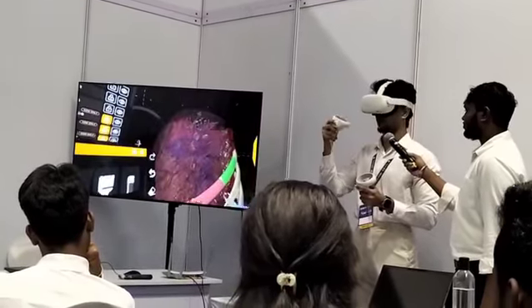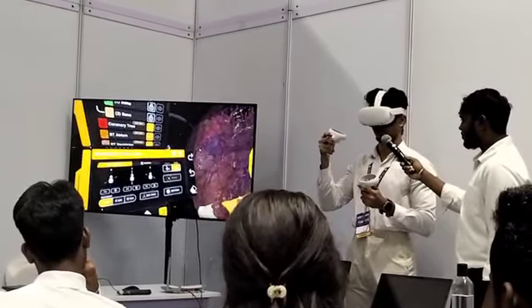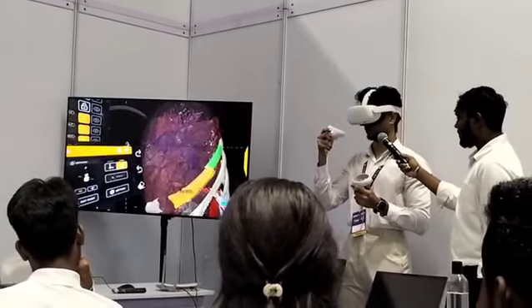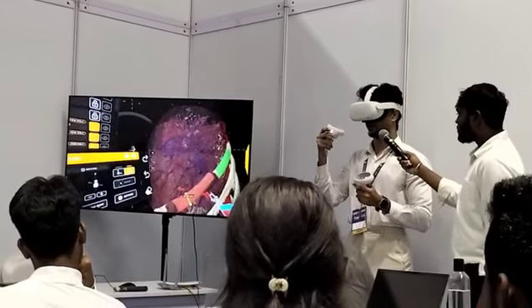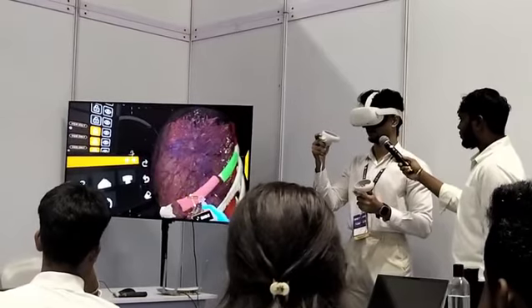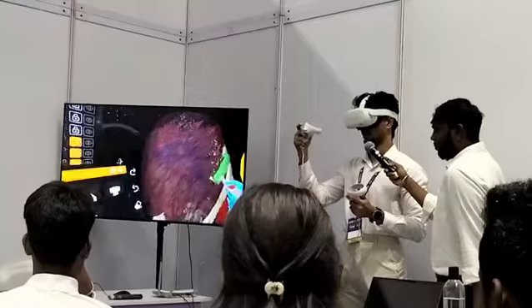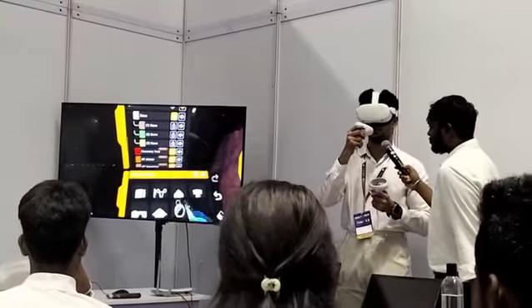Now I can either have this in its initial place and just move its positions, or I can grab it and take that part off completely and restructure it again. I'll be able to do that.